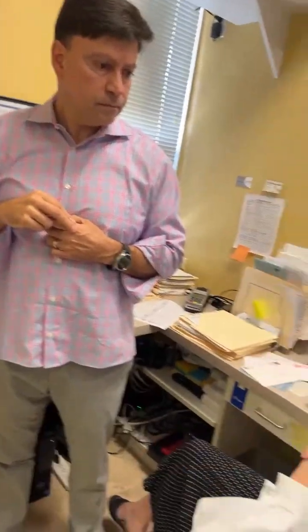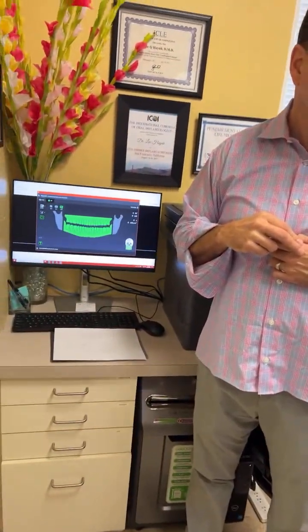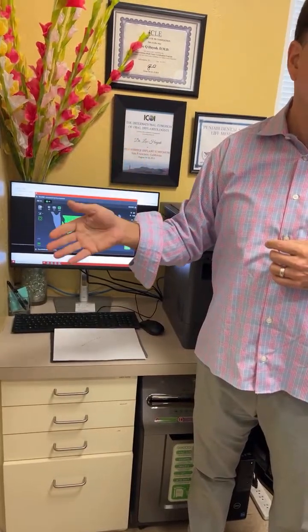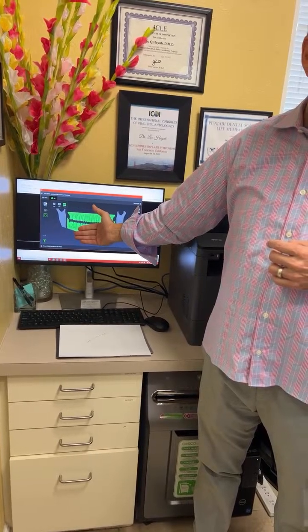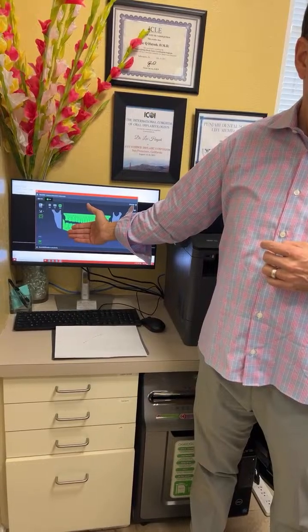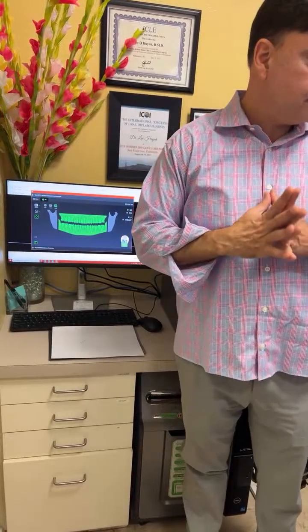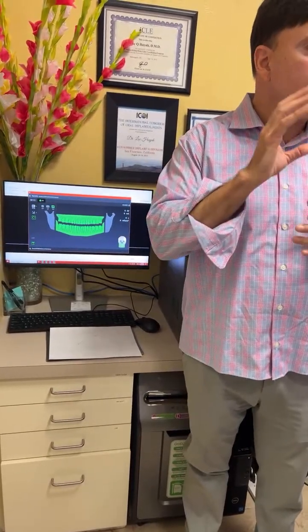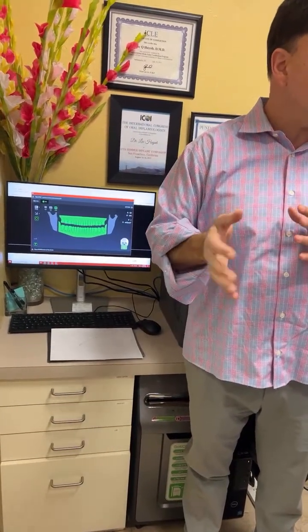So you're saying that before we take it, we can see whether the option we selected is exactly what the doctor is looking for? How can we review it before we hit the button? Because when you take the image, you're gonna get a preview of it, it comes up on the screen right here. I have to take first and then review later, so it will come out not what we want, and we have to retake again? No, don't think about it that way. Think about it as taking a preview of the patient, and you tell the patient, I'm gonna take a preview. It's called a scout.